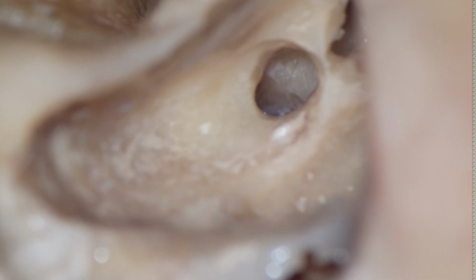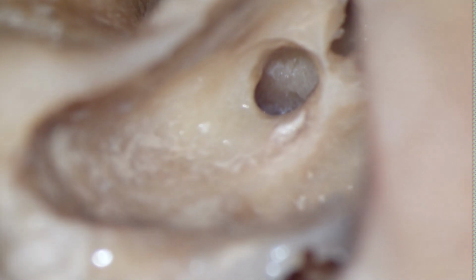Round window is a three-dimensional structure, right? So you have to drill the lip of the round window for easy insertion, so that there is no kinking. Do we have an electrode?